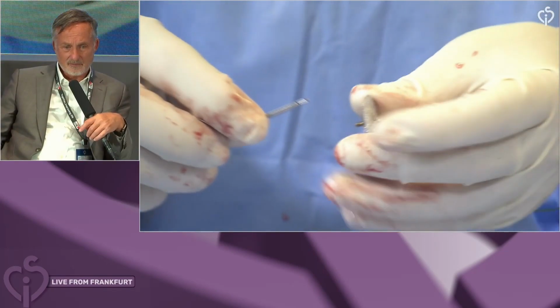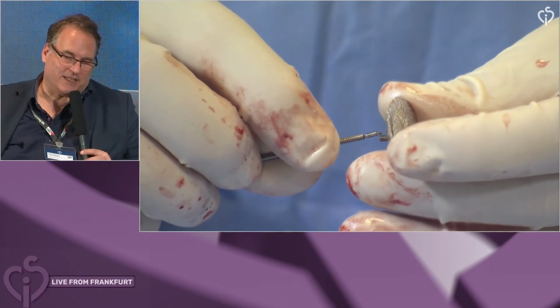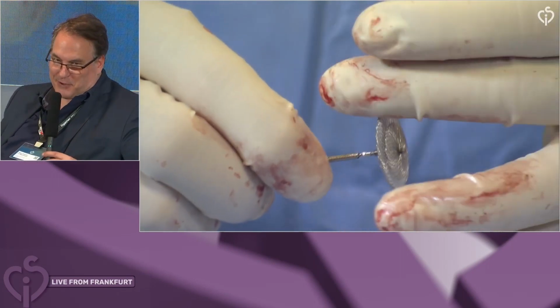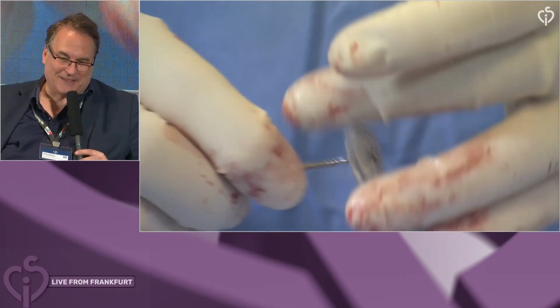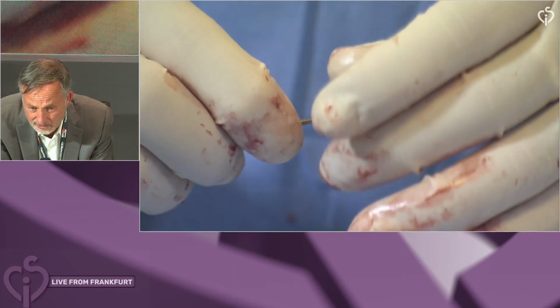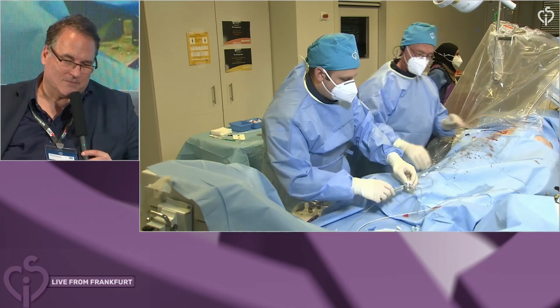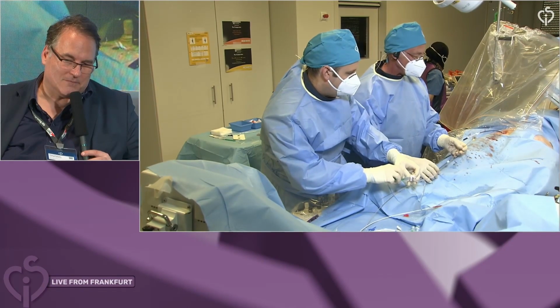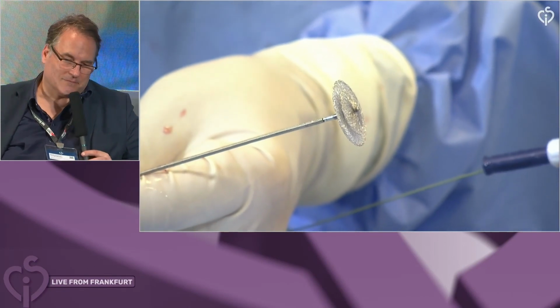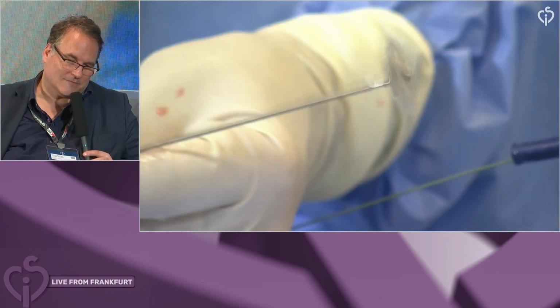So now let's look at the device. Again, this is like the old Amplatzer days device. That's why I like the Talisman, you know. You take it out of the box, it's already connected. So the 25 millimeters is the right atrial disc? Yes, and 18 is on the left side. And again, the difference to the Amplatzer device, this is coated with platinum, which makes it more valuable because platinum is platinum.